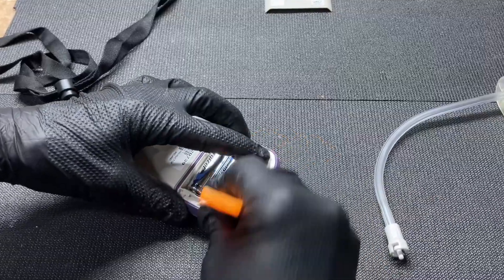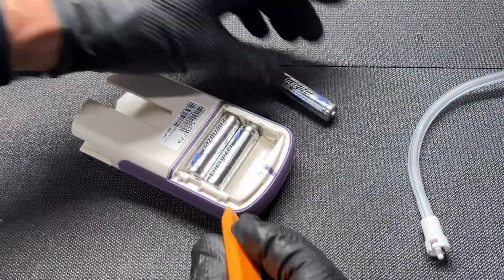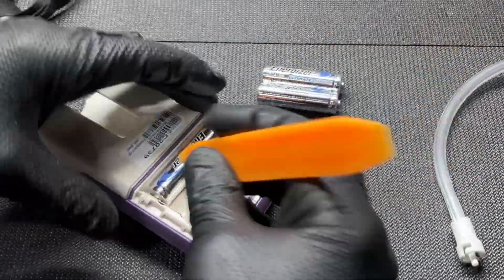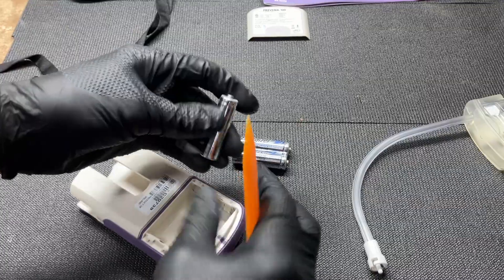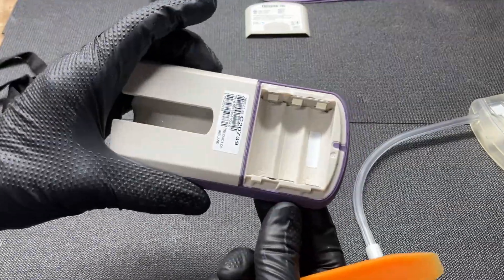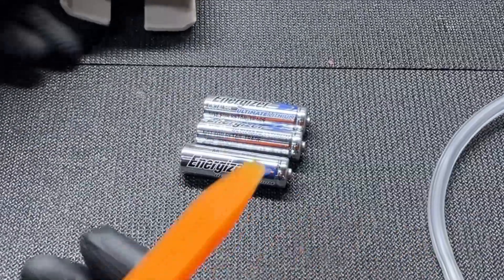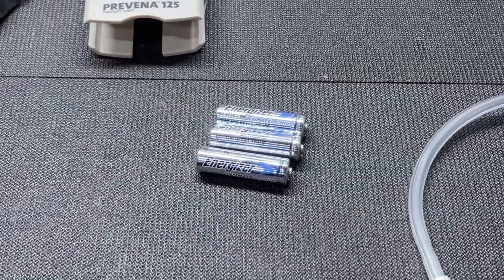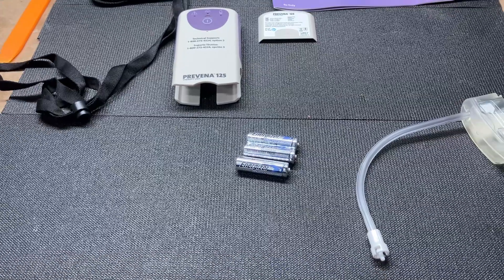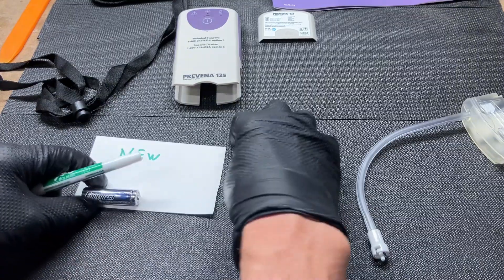Let's take the batteries out and look for some screws. A lot of times screws are underneath the battery compartment. Those are nice Energizer lithiums — top dollar. Of course, they charge about $500 USD for this unit, maybe more to insurance, for a disposable unit. It's a lot of money, but I can understand why they don't want to reuse it.